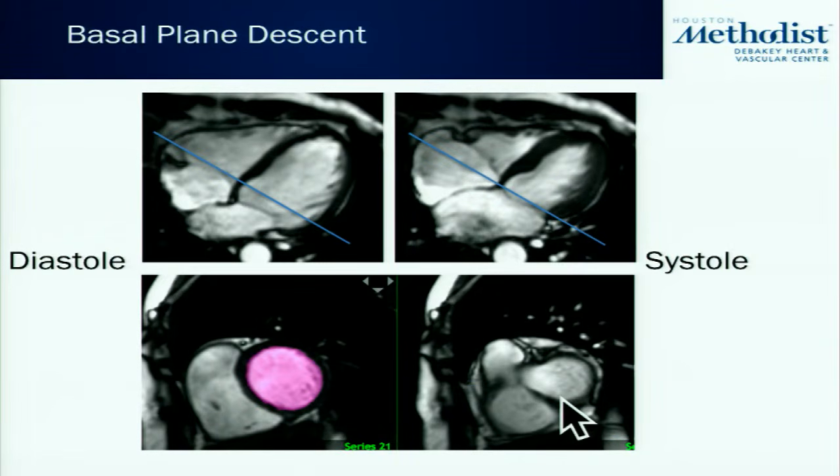Or some of the more recent post-processing algorithms actually allow me to place a dot here to tell the algorithm that that's where the base is. So if I have a slice right there, it will determine that the location I specified right here represents half of the slice, and then I would trace the volume, but it would just compute half the volume for that specific slice location. So there's two different ways to do it, manually or automated.